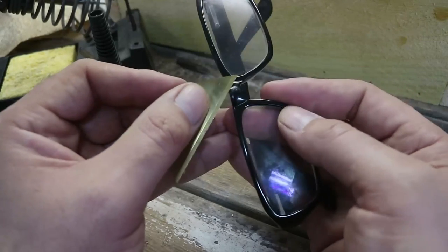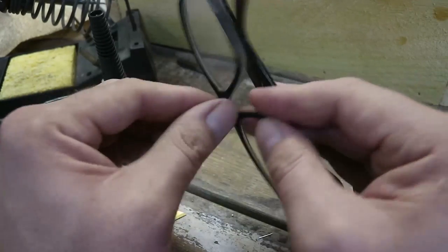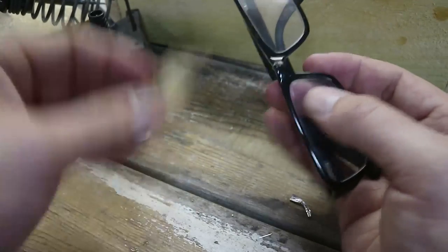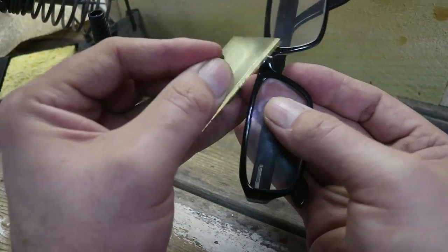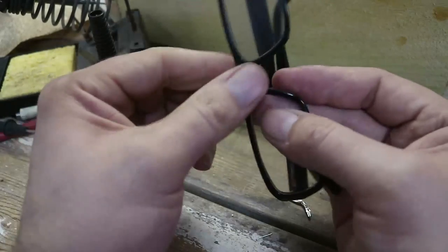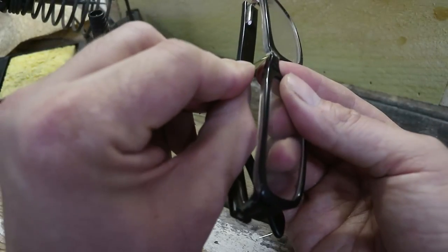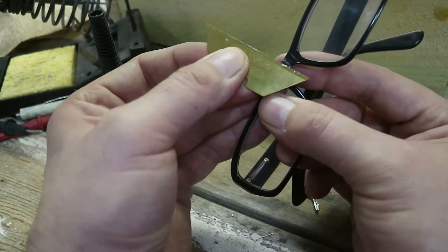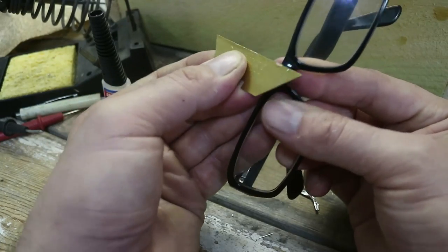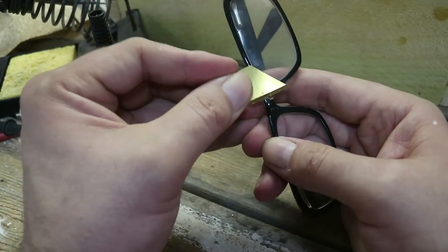hockey tape on here so I can look like a Revenge of the Nerds. Poindexter. Is that his name? I think it was Poindexter. Had the white tape and those black glasses. Such a good look. Hopefully, the little nail that I stuck in there as reinforcement will hold everything together. If not, I will repeat the process.